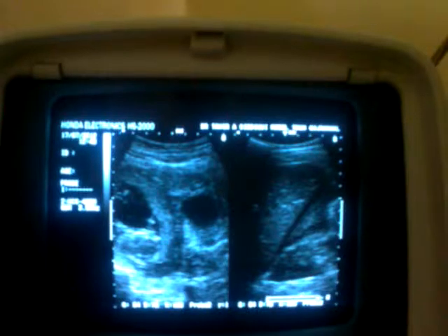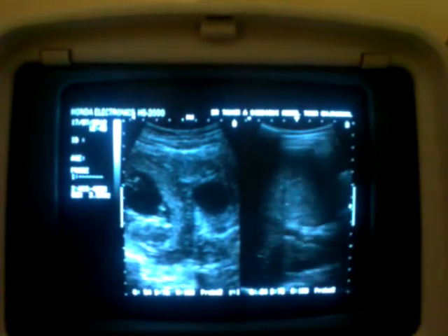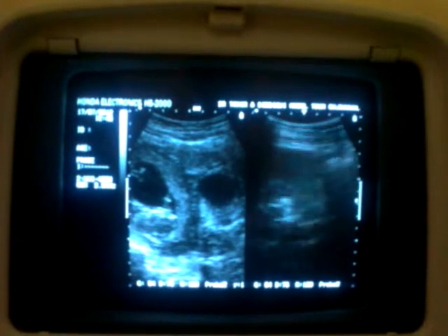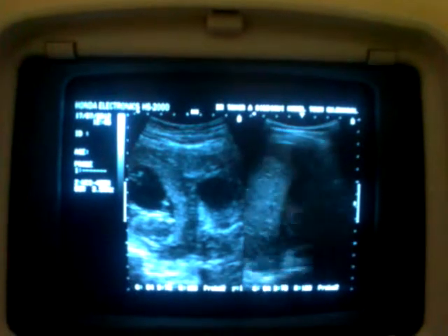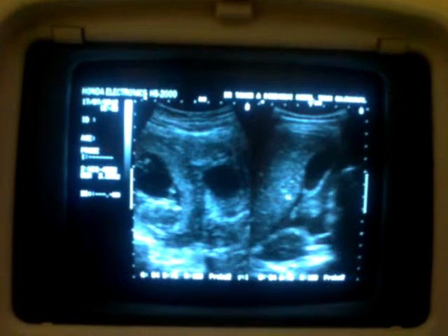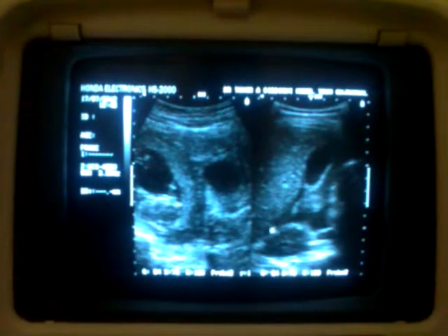This is the fluid. This is the right kidney. This is the margin of the liver. This is the fluid. So fluid is seen in the hepatorenal angle. This is the gallbladder. Fluid is seen. It is in fact black. So here you are. This is the portion of the right kidney. This is the liver. This is the boundary of the liver, gallbladder, bowel, and all of the black area that you are seeing is the bleed. So this is Morrison's pouch.